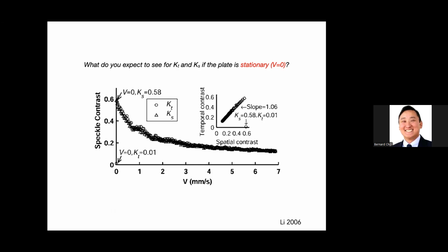We'll get into the why, but if I just plot the spatial and the temporal values against each other, pairing each one of these points, I get this nice linear fit here, and then it just drops off right here, where this point is plotted against this point. Okay? So the theory works, and then at some point it doesn't seem to work anymore.